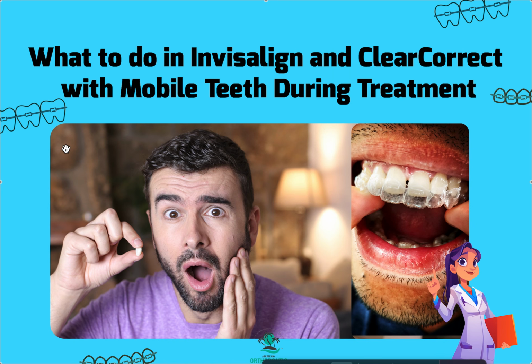But even if you didn't get the Ceph, we can look at the profile and we can look at the treatment plan, and we can pull up that TMT, or that tooth movement table, which is now available in Invisalign, in ClearCorrect, and in my white label company Global that I use. Those are the 3 companies I use. I can get a TMT and scroll down, look at every single tooth, and I'm going to look at buccal lingual movements, and I'm going to see, did the front teeth move buccally?